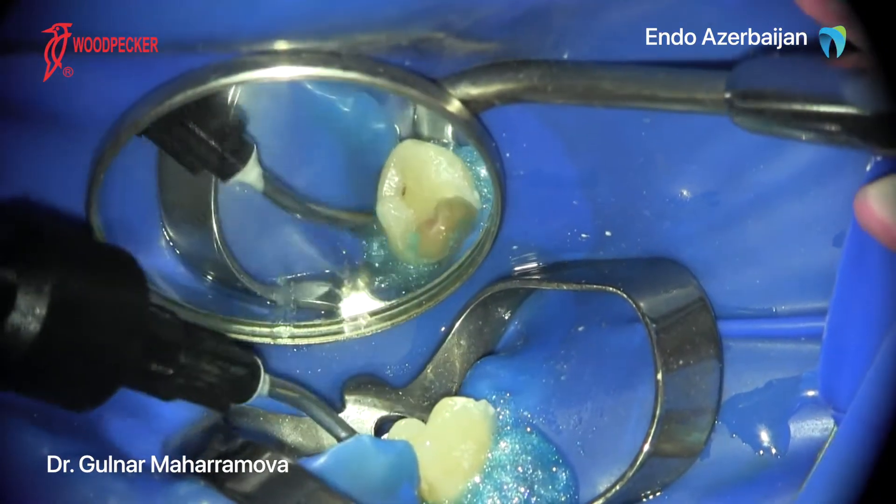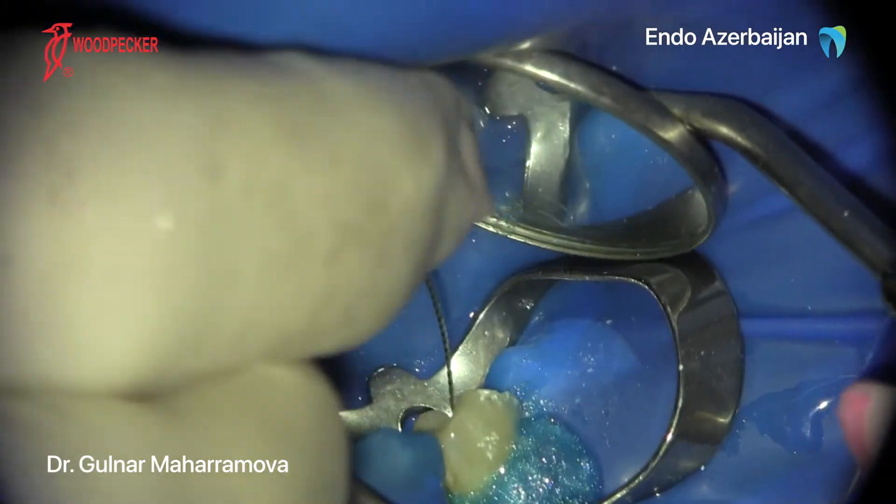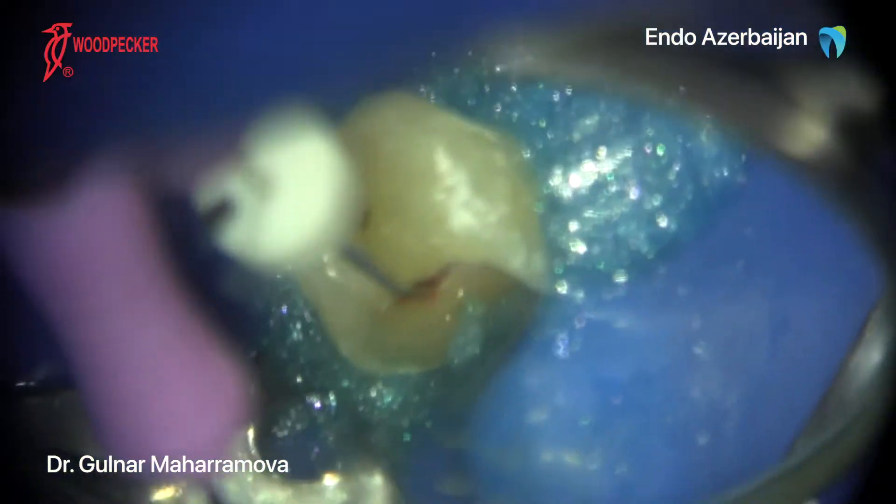As the name goes, Motopex combines the function of an endomotor and an apex locator in one device. All you have to do is to place the clip and keep the electronic apex locator mode on, so you can control the length of shaping.